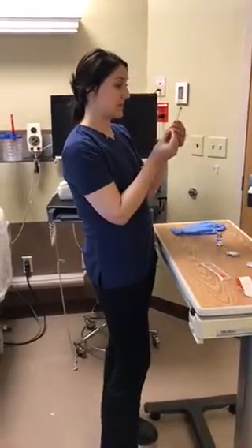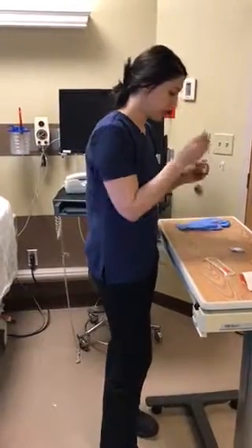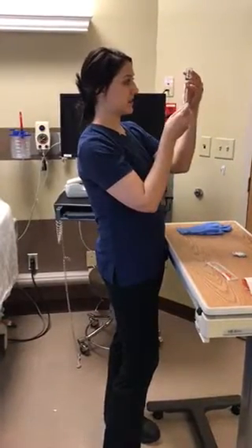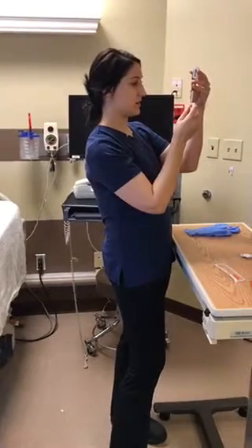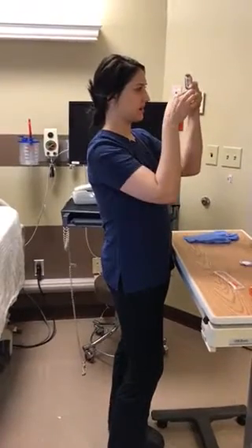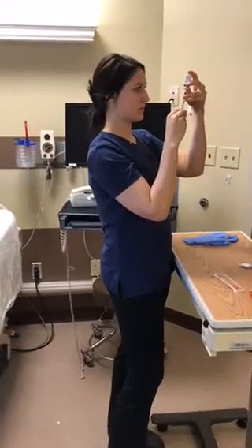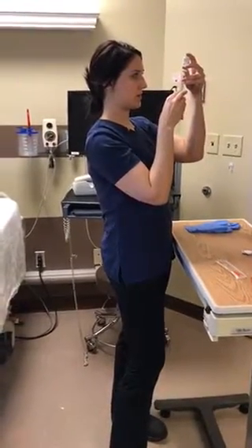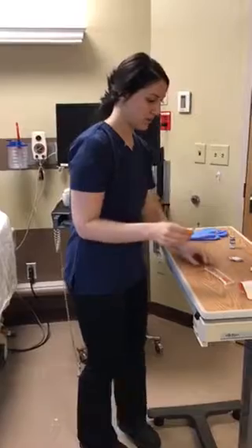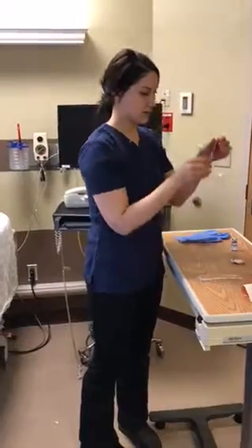I'm going to draw up 10 units of air into the syringe. Insert that into the rubber stopper, insert the air into the vial, and then draw out 10 units. I'm going to flip that to get the air bubble out. Okay, I'm going to remove that from the vial. And then with the scoop technique, I'm going to put that up and secure it.